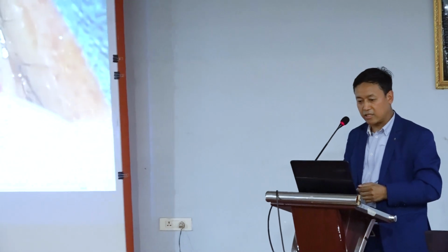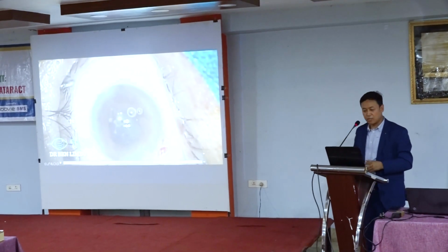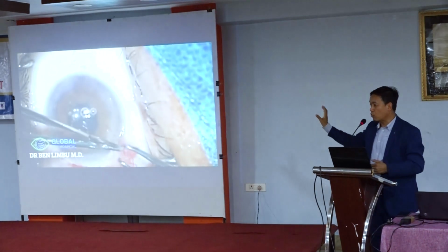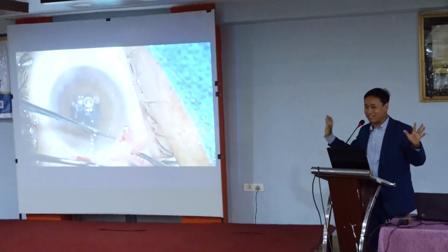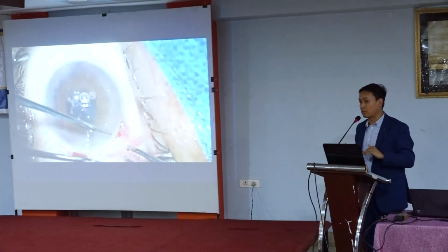So we remove the cortex. And I also did an anterior vitrectomy on this patient and removed some cortical part. And finally, I gave a lens into the sulcus on this patient. So the main learning point, this is the end of the surgery. I gave Miochol on the patient, and then the pupil got constricted. It looked almost normal. Nobody knew what I did at the end of the surgery. But I should have placed the iris hooks before I started my case.